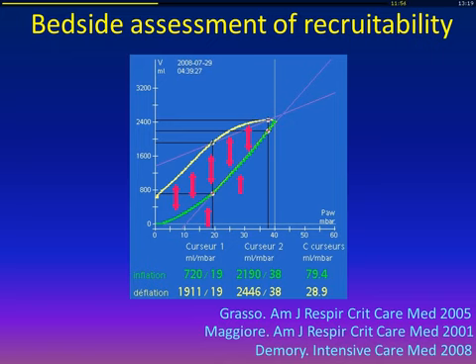So we have to use a very low ramp, as low as possible. It's a slow flow PV curve and no pause. If we set a pause, it's already a recruitment maneuver. So on top of the current ventilation, we will do a PV curve. So pressure will go to 0 for a few seconds, and the pressure will increase from 0 to 40 over 20 seconds, and from 40 to 0 over 20 seconds. So the full maneuver will last 40 seconds.